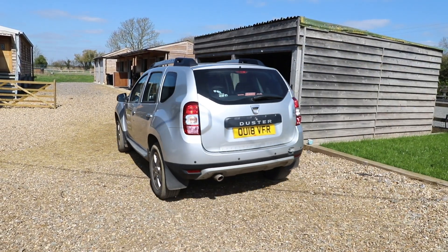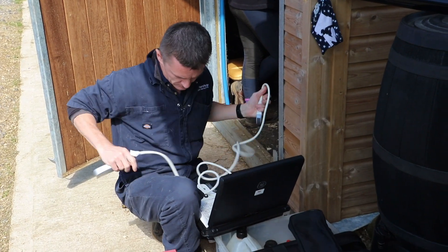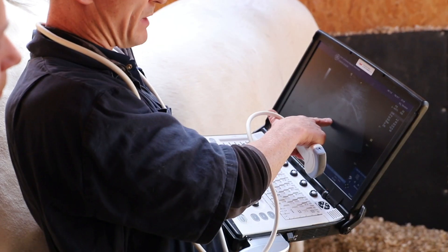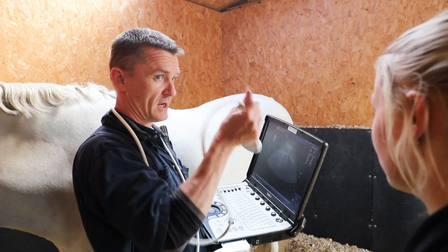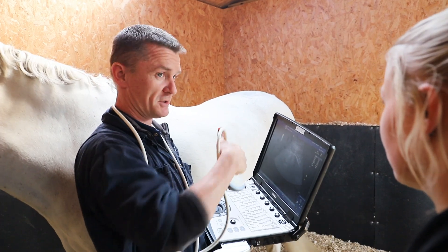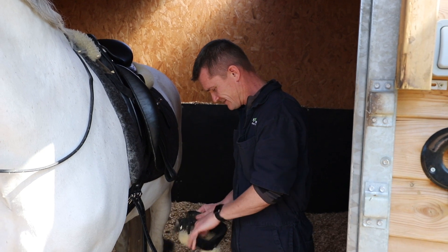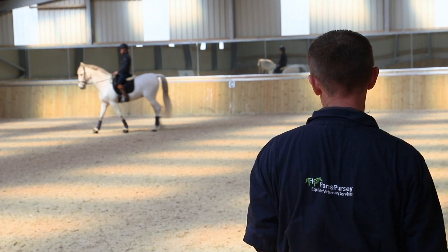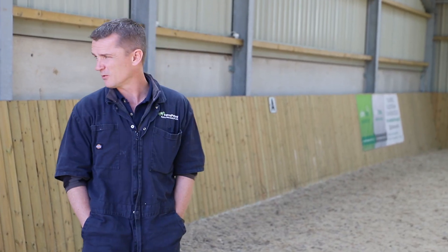We picked up the new Logic R7 unit. The speed and battery life is infinitely better than the previous Logic we did have, and it adds to our complement of equipment we can take out into the field. Our old Logic BT12 system was great in the field, no problem, but the issues I found from a practical point of view were battery life and also the speed at which it booted up.